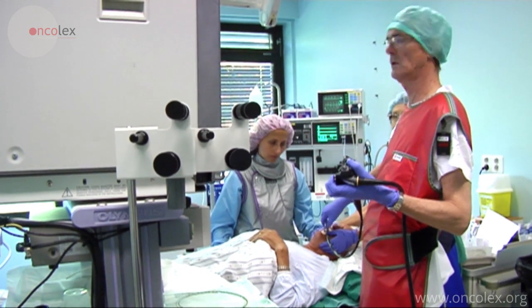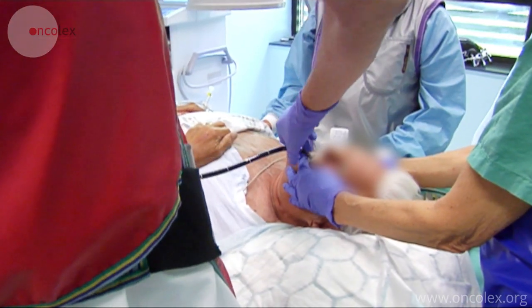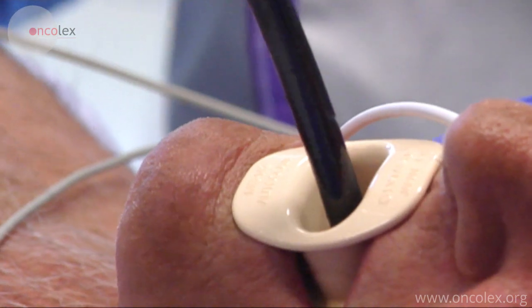This is a video of an esophagoscopy with placement of a self-expanding stent. The gastroscope is inserted down into the esophagus to localize the tumor area.